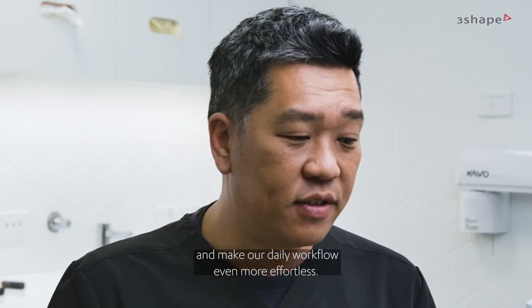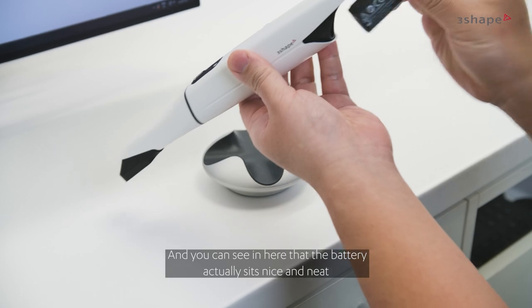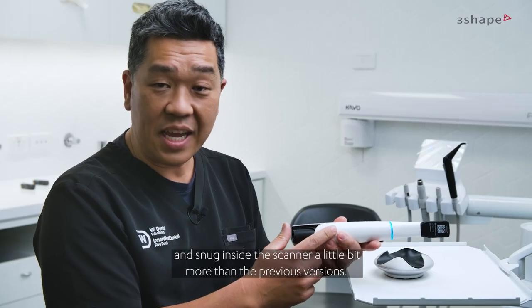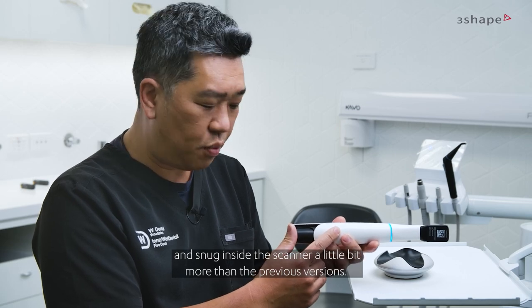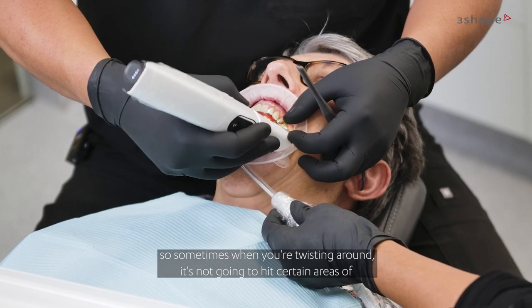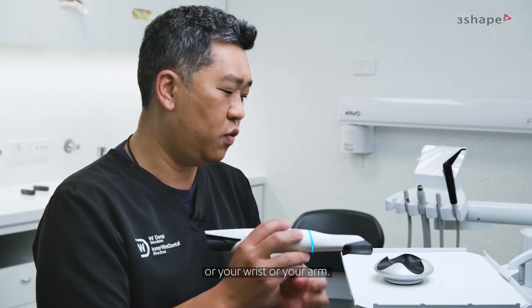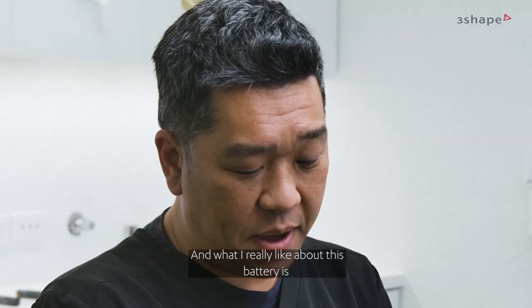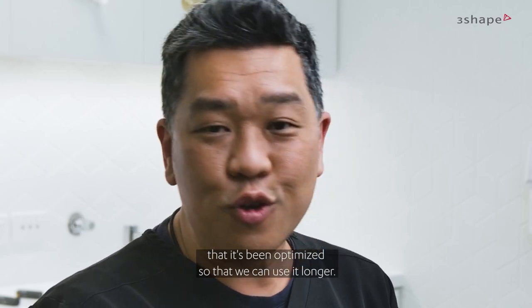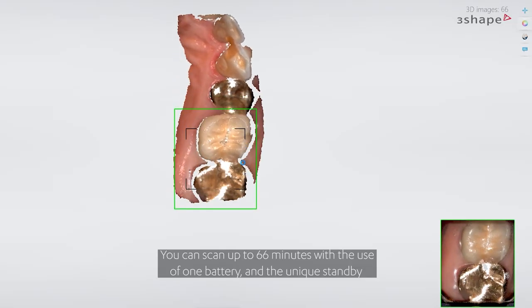Some of these features have helped us make our daily workflow even more effortless. You can see that the battery sits nice and neat and snug inside the scanner — a little bit more than the previous versions. The battery itself is also slightly shorter, so when you're twisting around it's not going to hit certain areas of your wrist or arm. What I really like about this battery is that it's been optimized so we can use it longer — you can scan up to 66 minutes with one battery.